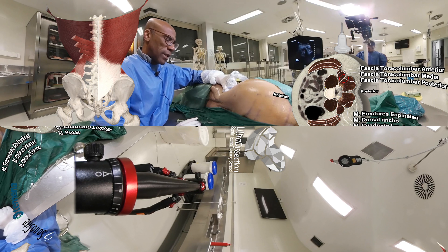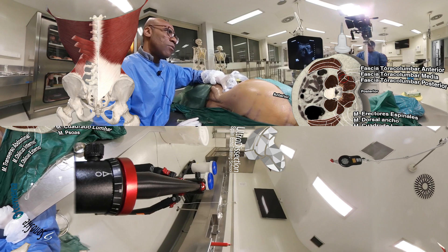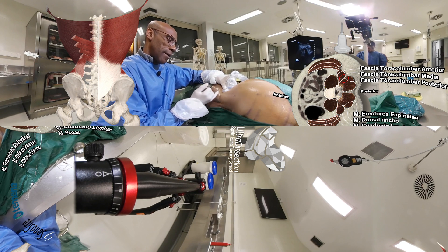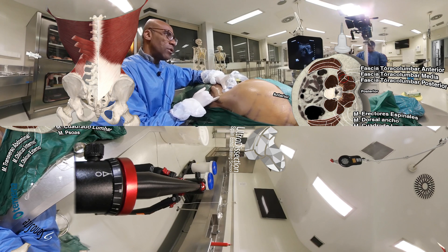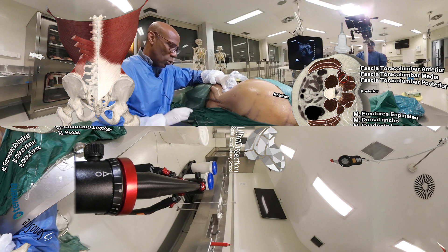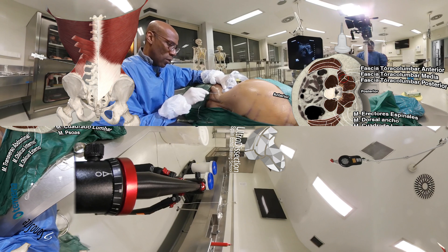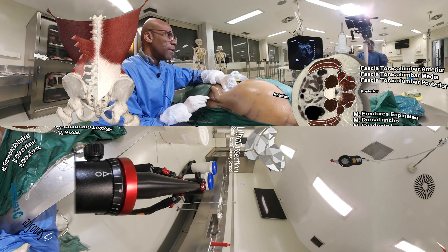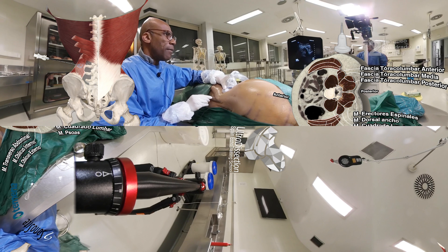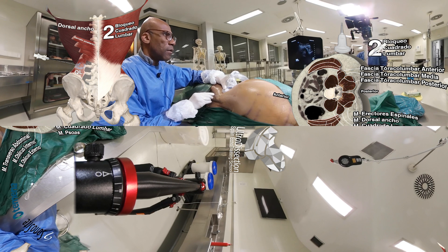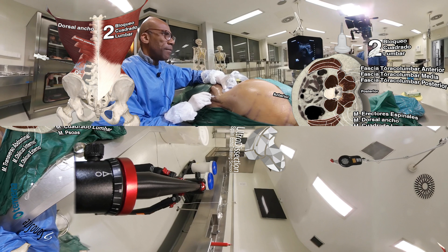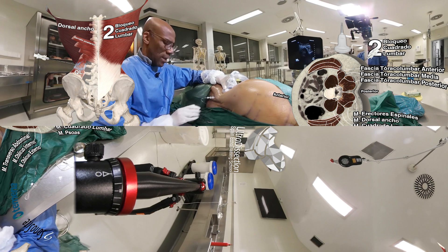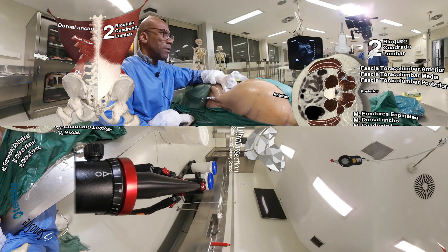The Type 2 block of the lumbar quadratus is made between the latissimus dorsi muscle and the quadratus lumborum. We are placing our probe line. We see our fingers, and here we are performing the block of the lumbar quadratus Type 2.